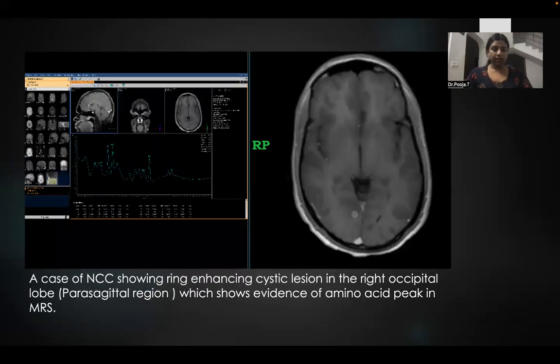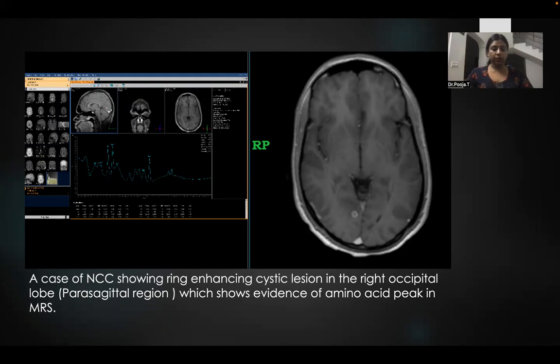This is a case of neurocysticercosis showing a ring enhancing cystic lesion in the right occipital lobe, that is the parasagittal region. The MRS in this case shows evidence of an amino acid peak.